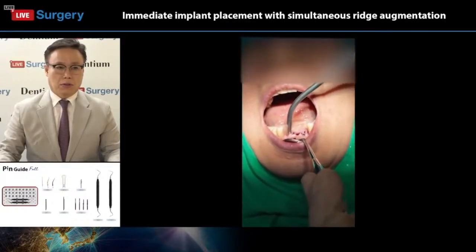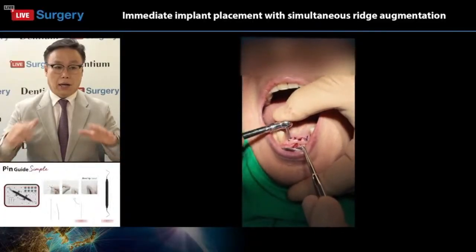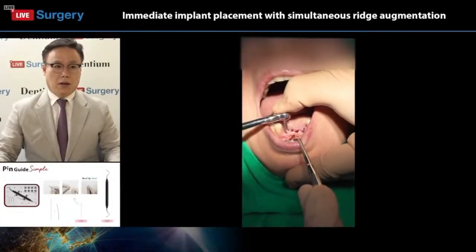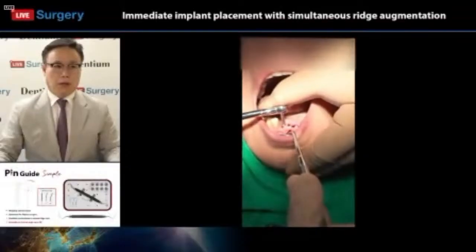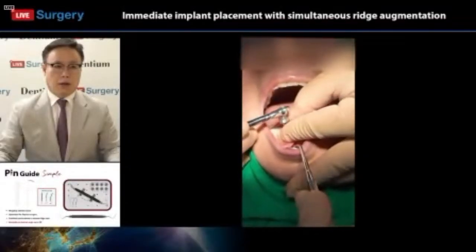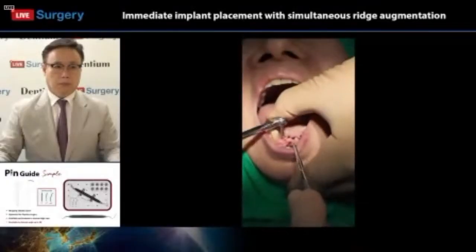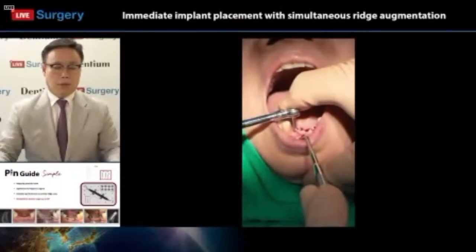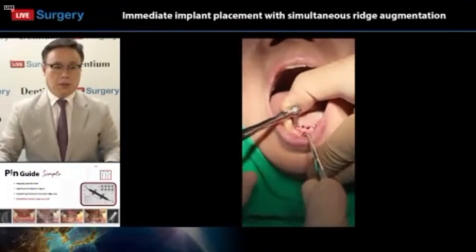So with the soft tissue graft and vestibular incision, we are checking, and probably positioning the implant a little bit higher. I evaluated it, so making a minor change of the implant position vertically.